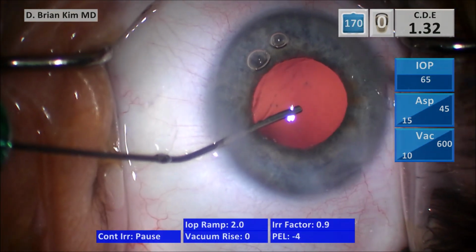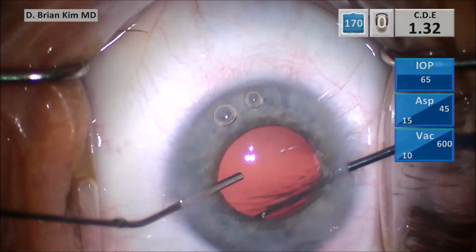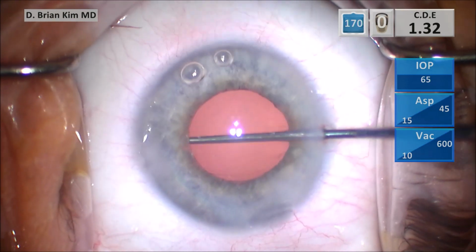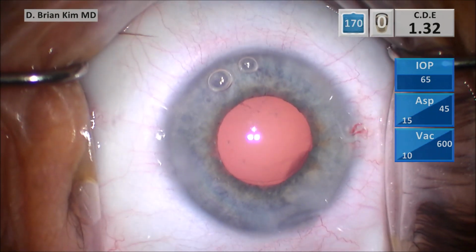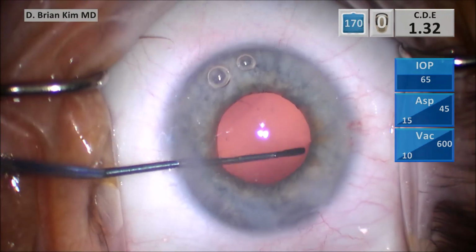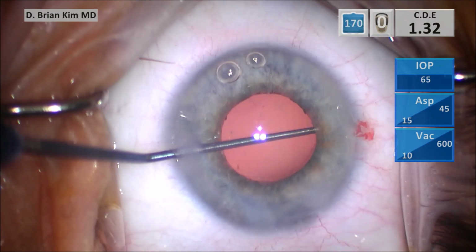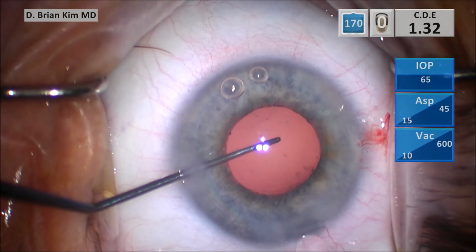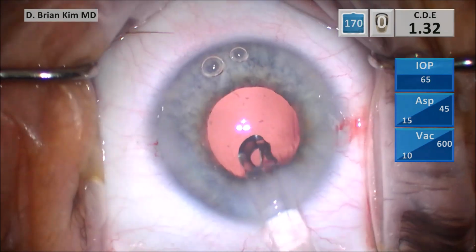And then I'm using the sweep to polish the anterior capsular surface, first sweeping on the left side and then on the right side. I try to limit how aggressive I am with the sweep when the pupil is smaller in a situation like this. I'm injecting my single piece acrylic intraocular lens into the capsular bag. Make sure the leading haptic's in the bag.